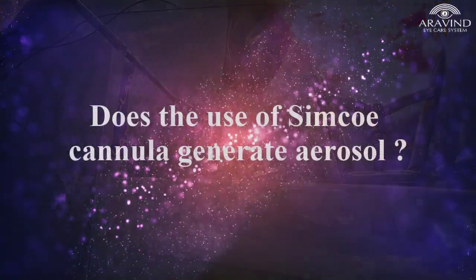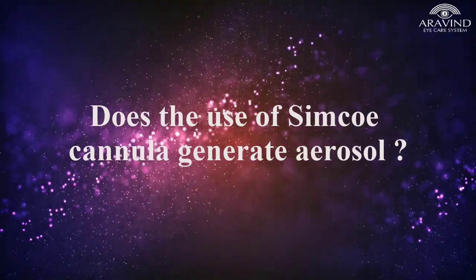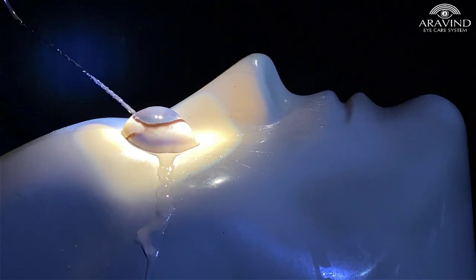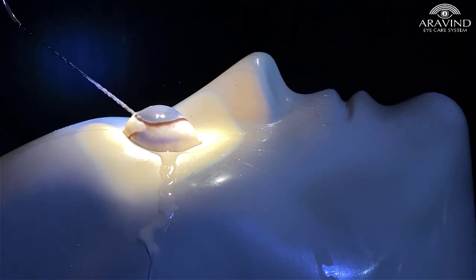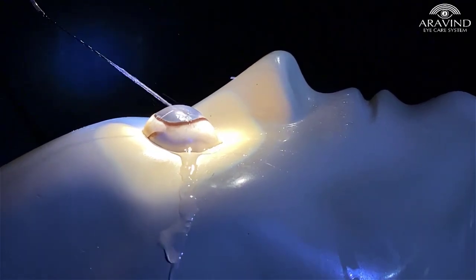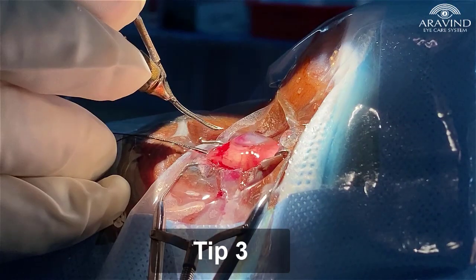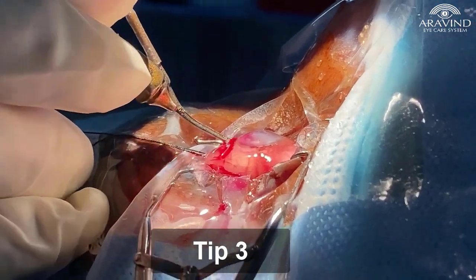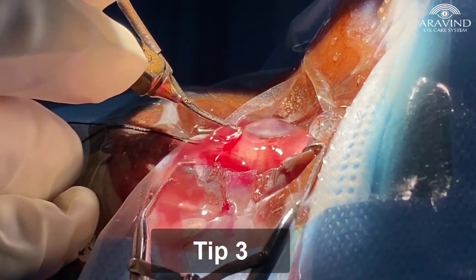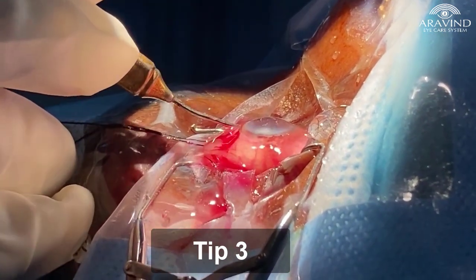Does the use of Simcoe cannula generate aerosol? When the irrigation from the Simcoe cannula hits uneven surfaces — especially after the conjunctiva is dissected and tunnel fashioned — it can generate aerosols. Enter the viscoelastic-filled eye with the irrigation closed, and open the irrigation only after entering the anterior chamber.